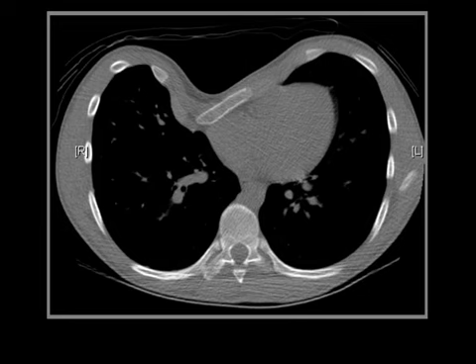So here's an example of a low-dose chest CT looking at a pectus abnormality, which is, as you can see, a sternal abnormality. It was funny. I was watching TV once with my kids, and there was this Disney show with fun tricks that kids could do. They had two brothers on there, and their trick was that one kid would pour Cheerios into the other kid's chest, pour milk, and eat it out of it. And he had a huge pectus abnormality.